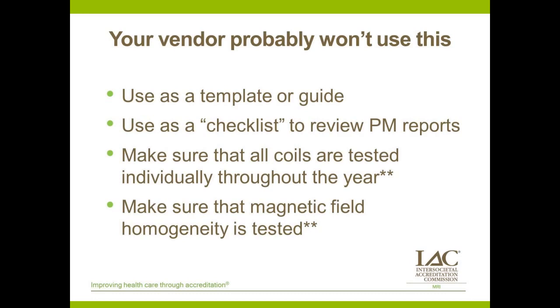This is a big area where some companies will just have a line item that will say RF coils checked, right? And then there's a check mark or a pass. And so that could lead you to ask some questions like, well, when you check my RF coils, are you testing their performance? Or are you making sure that they are clean and that they don't have damage to the cables, damage to the pins? Are you plugging them in and just making sure that there's a simple functional electrical check? All those things are important, but a mechanical inspection, an electrical inspection, a simple plug-in, does the scanner recognize it type check, doesn't take the place of actually doing a scan with the coil and checking its imaging performance.